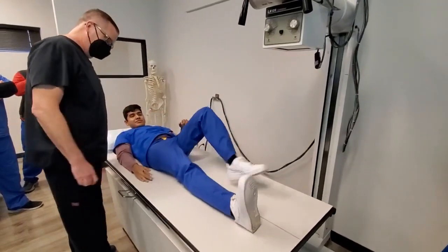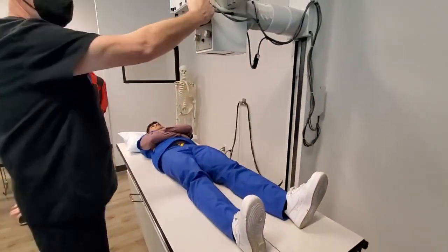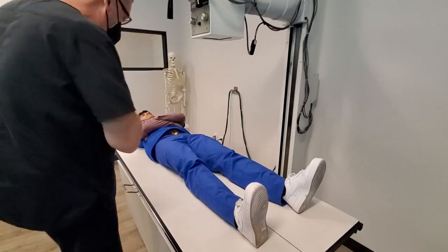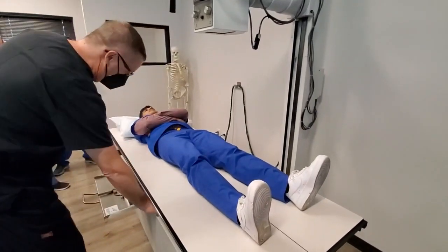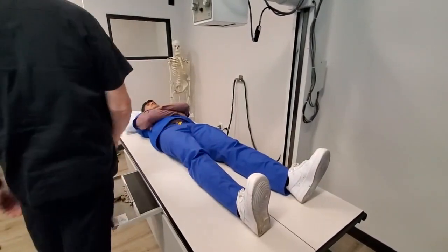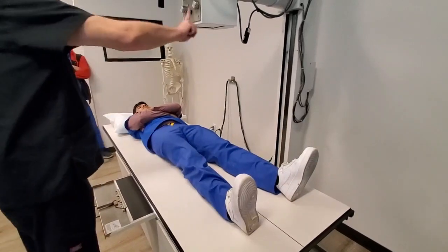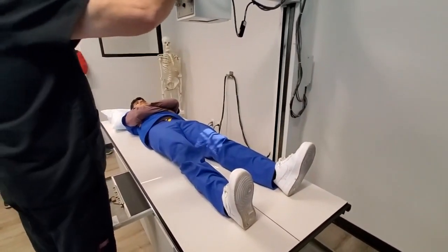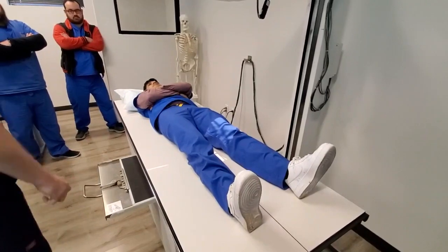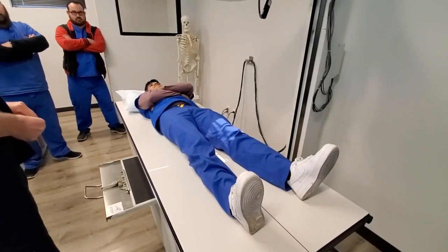Go ahead and straighten both legs out for me. What are we going to have our central ray at — where do we want our central ray for this projection? Half an inch inferior, or half an inch distal, to the apex of the patella. Your cassette orientation can be either lengthwise or crosswise; lengthwise is easier just because we're doing the long part of the body. Normally your patient would not have pants on. Now that we're using the Bucky, we always have to be detented. If he was a lot thicker, what type of angle would we have? Five degrees cephalic if we needed to.